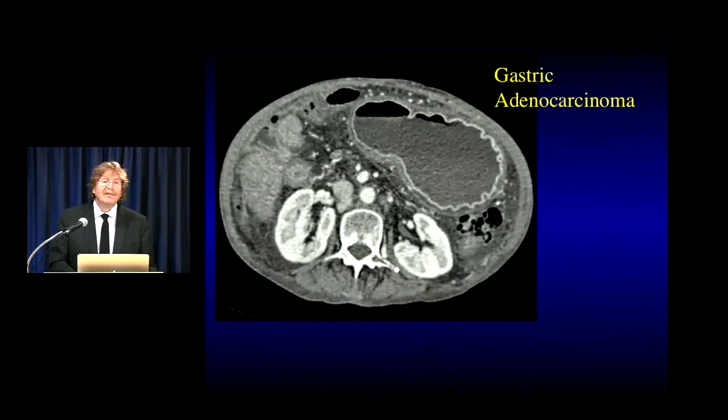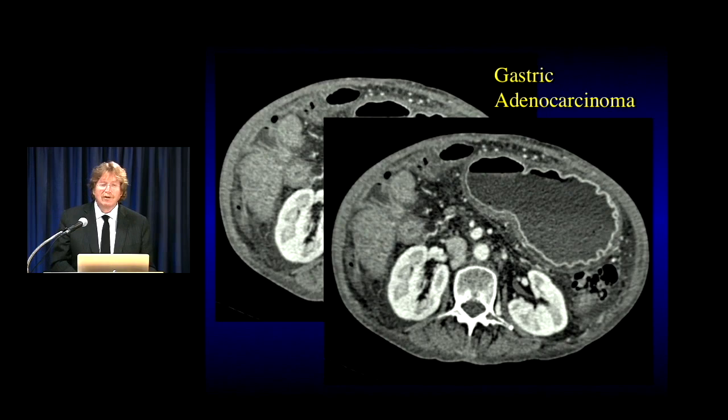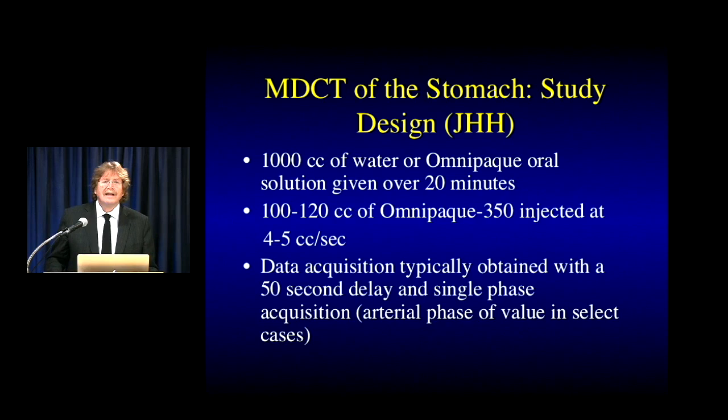When looking at the stomach, you'll often see mucosal enhancement. If you see a break in the enhancement, you have to worry about a tumor. When you have lesions in the antrum, coronal views are very helpful because otherwise you get partial averaging. You can see the stomach with ascites, and I'm concerned about carcinomatosis. In coronal view, you really nicely see the infiltration into the antrum — much easier to recognize, whether it's coronal MPR or volume rendering.